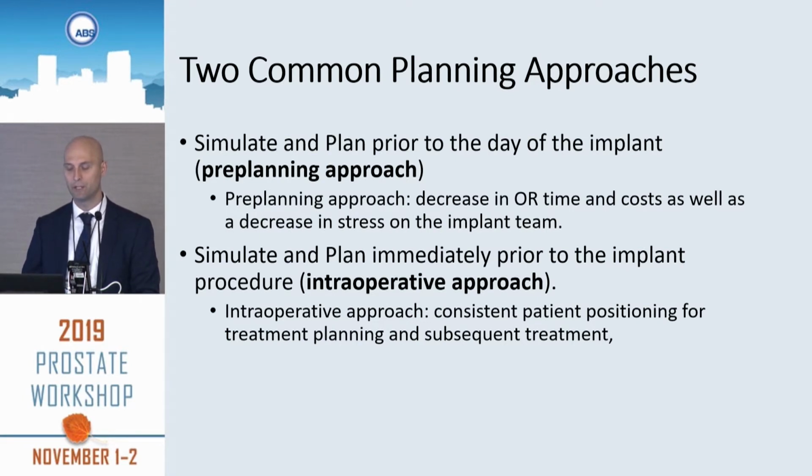The other approach is the intraoperative approach, where you simulate and plan immediately prior to the implant, and that gives you very consistent patient positioning for treatment planning and subsequent treatment, and you can even monitor the dose as it's being delivered. So there are really pros and cons to these. People have done both workflows very successfully, and as an institution, as a team, you have to decide which one you favor.